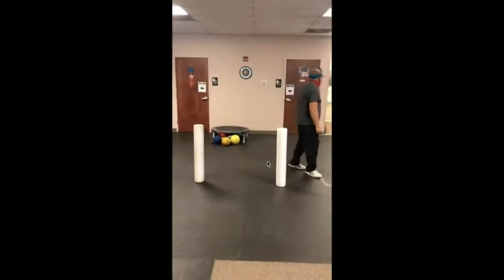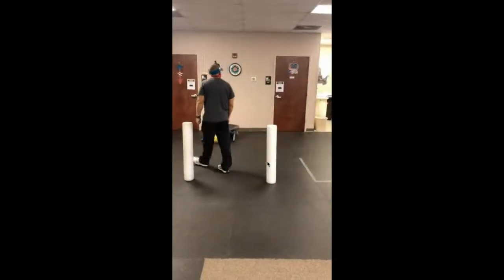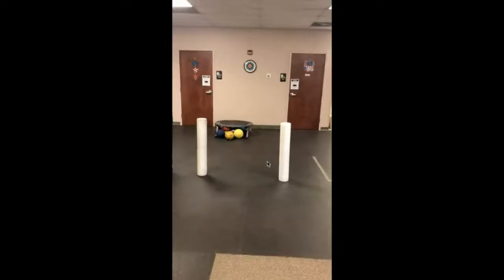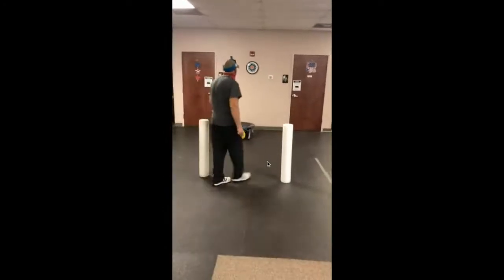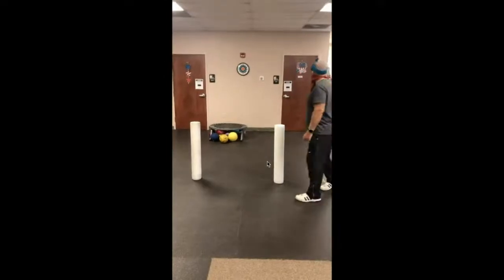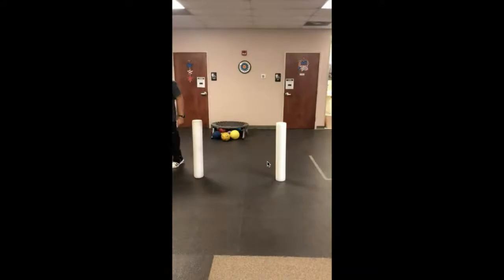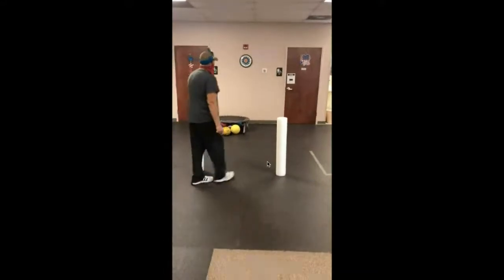When he has to come back around and go to the right, he really lags behind. He's almost back to the foam roller as the target by the time he gets the laser to the target there. So you can see how delayed that is when he has to turn toward his right versus turning toward his left.